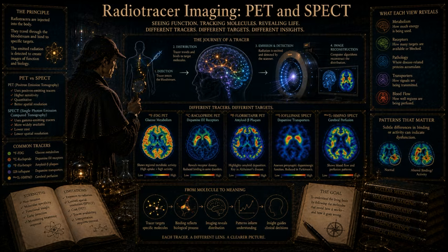I can imagine. If a patient has a condition that alters the lipid composition of their cerebellum, or if the tracer sticks to a protein that is uniquely expressed in the hindbrain, the entire mathematical house of cards collapses. Your reference tissue is corrupted, and your calculation of BPND in the striatum will be totally false. So it is a calculated risk. But when it works, it allows you to calculate receptor density without ever drawing a drop of arterial blood. Yes. It opened the door to scanning massive cohorts of psychiatric patients safely and comfortably.